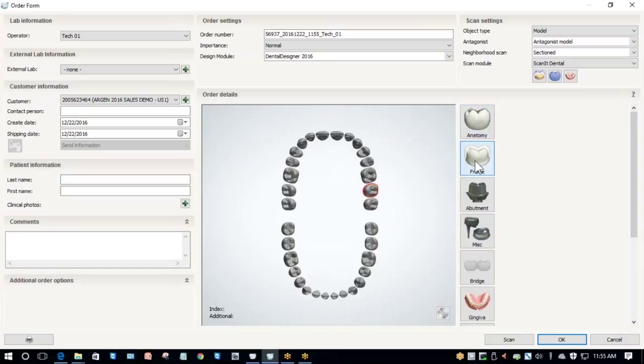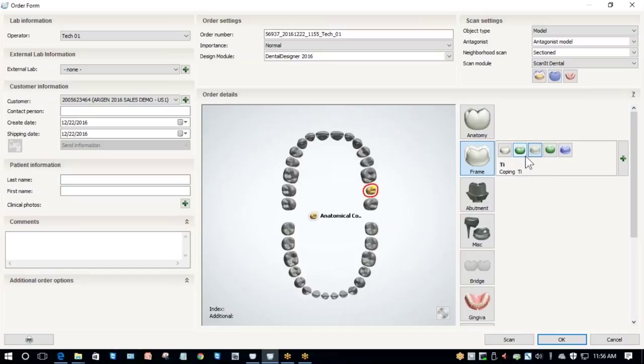If I were doing a framework, I could go over here, select frame, and choose any one of my frame options. These green ones are pontics and these white ones are standard copings.